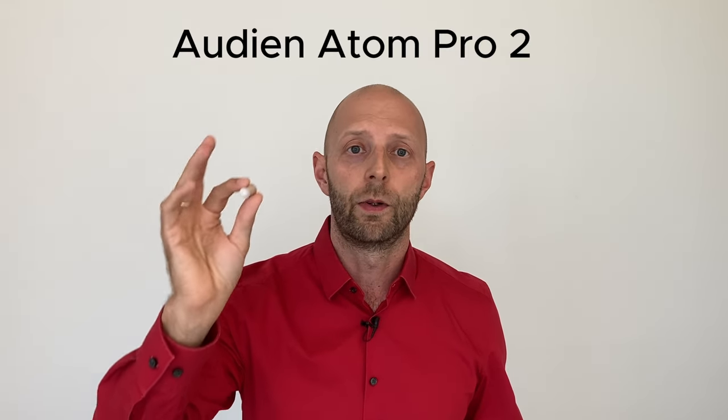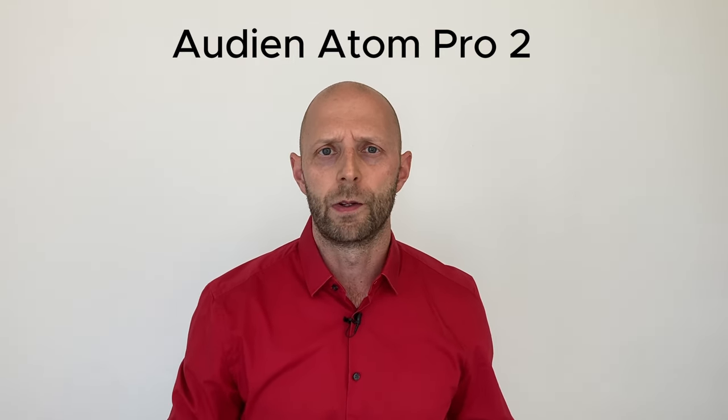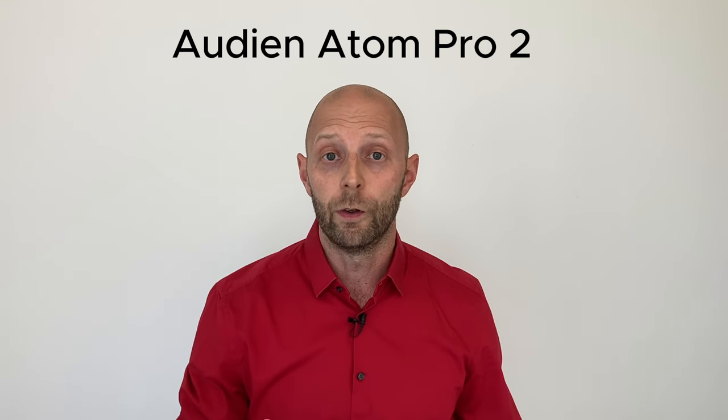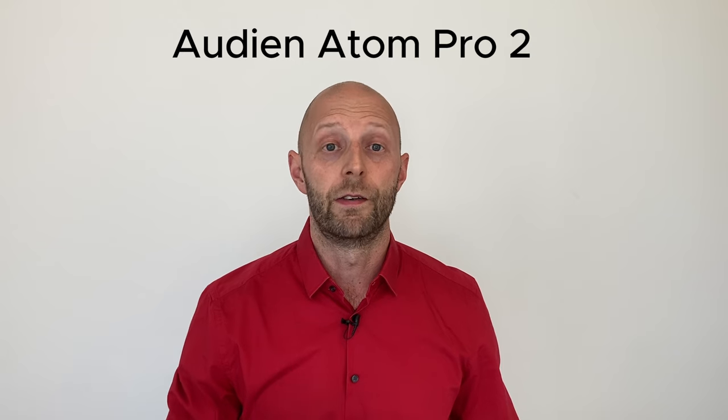Hello again, my name is Dave, and I'm a hearing professional with 25 years of experience in fitting hearing aids. Today I'm going to have a closer look at the Audien OTC hearing aids, the Audien Atom Pro 2. If you're into OTC hearing aids, you've probably heard the brand Audien before — they are well known for being very affordable.